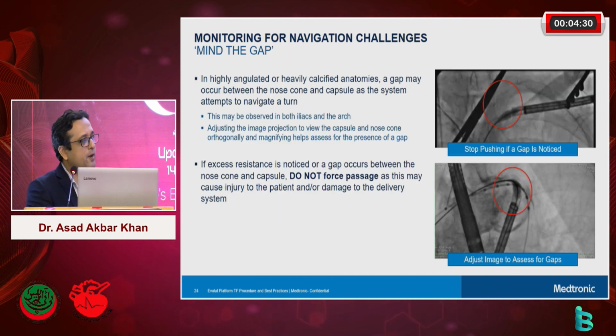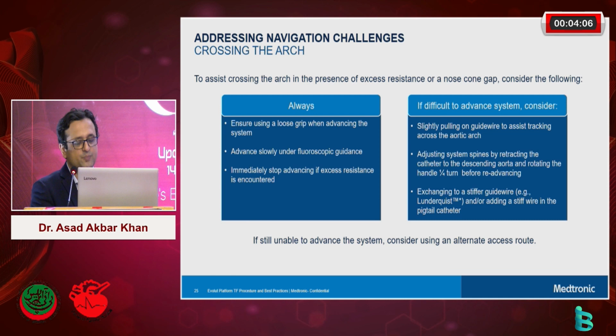But the point here is you do not force. You don't force. It's already a sick patient. You cannot afford even a single complication in them. So you don't force it. And if you're forcing it too much, there is a safety valve system in the device itself. If you force it too much, it just breaks at the back. And that means you cannot deploy it. You just have to bring it back up. But that requires a lot of force. A lot of times complications can happen long before that. People have put in a safety check, but sometimes you don't reach that.